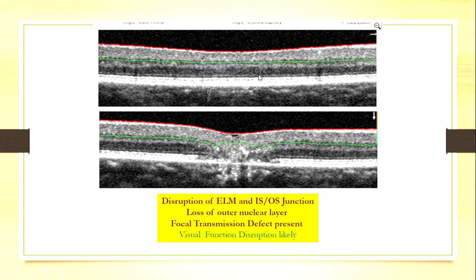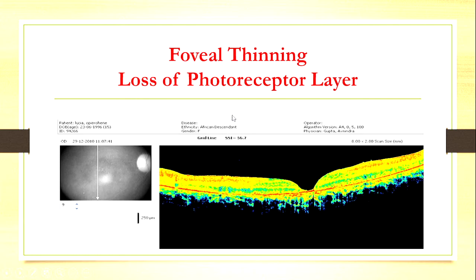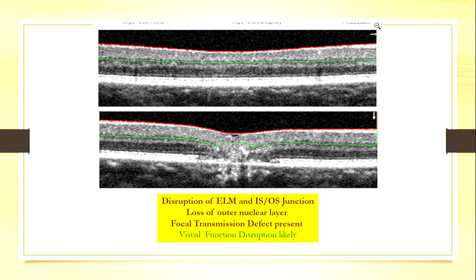You see all the layers are intact here — the ELM, the external limiting membrane, the ISOS junction, the RPE. But look over here: this outer nuclear layer has atrophied. It's fallen down. The photoreceptor layer is gone. The ISOS junction is not intact. And so, in this situation, there is likely to be a visual deficit.